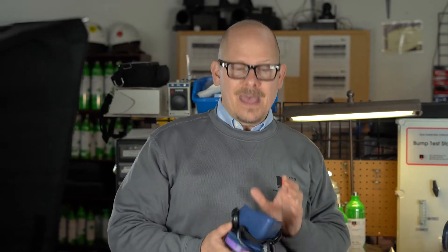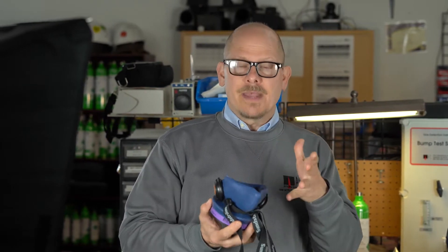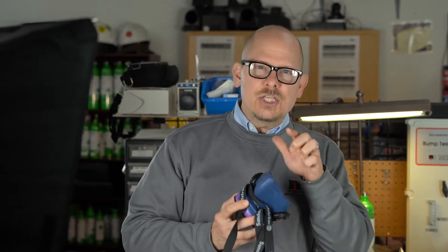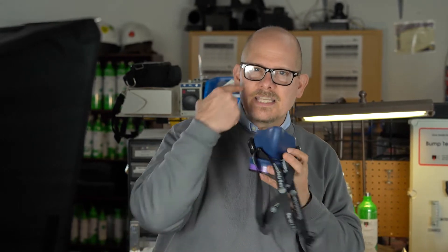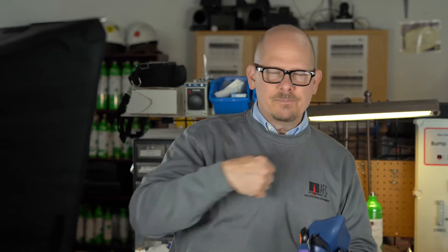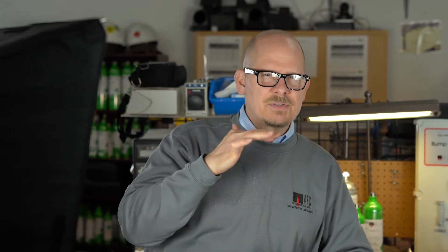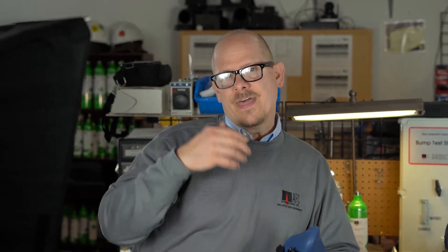I want the best fit — picking a mask or a series of masks or different manufacturers of masks that gives each employee the best sealing surface and best fit. Qualitative is good: banana oil, irritant smoke, Bittrex, saccharin — those are all great. But when it really comes down to it, if I have a choice, I'm going to use a quantitative fit tester like the AccuFit 9000.